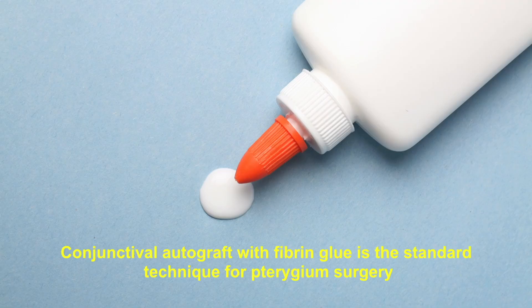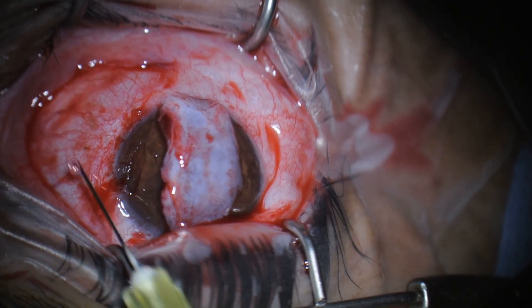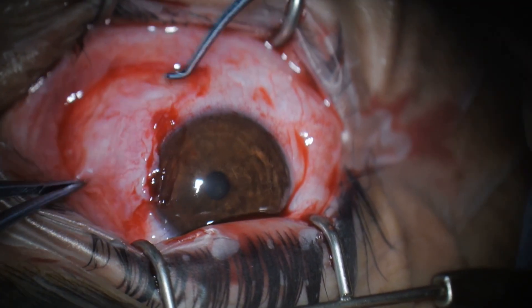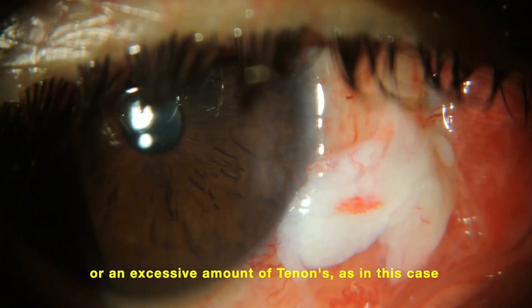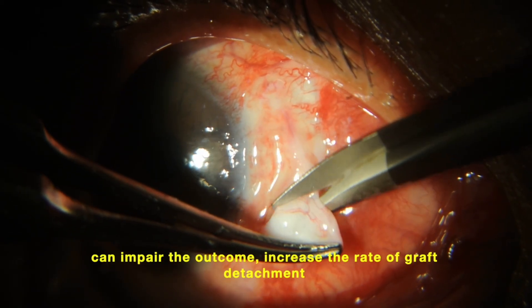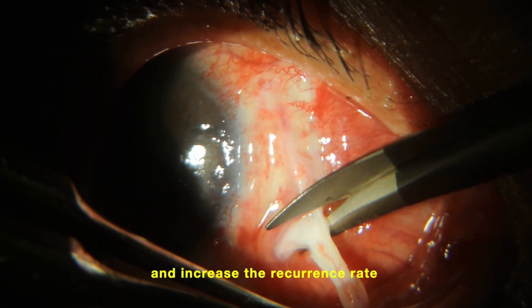Conjunctival autograft with fibrin glue is the standard technique of pterygium surgery. But a graft with a thick Tenon's capsule, or an excessive amount of Tenon's as in this case, can impair the outcome, increase the rate of graft detachment, and increase the recurrence rate.